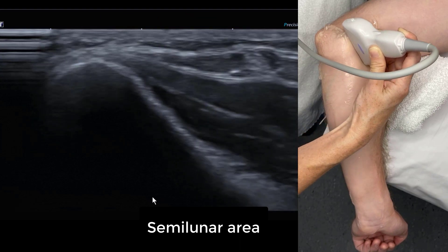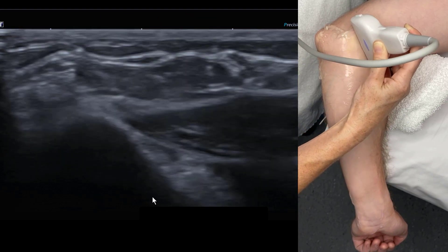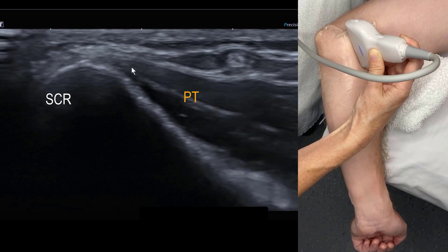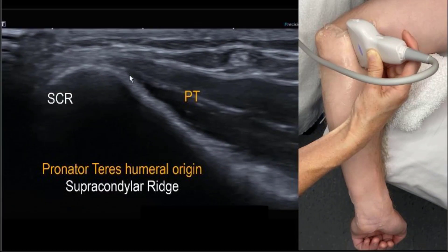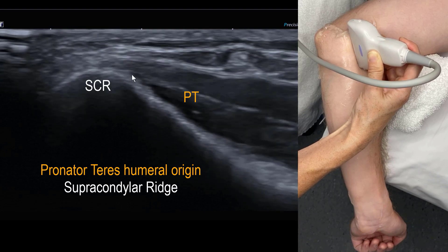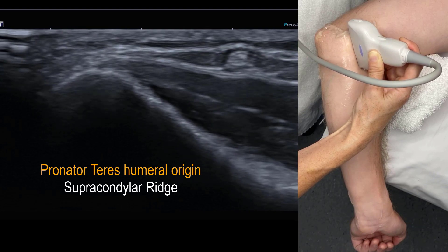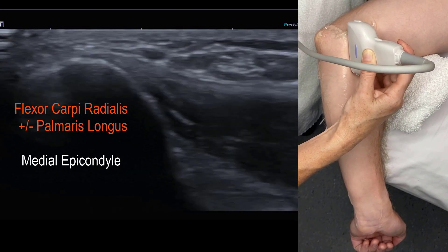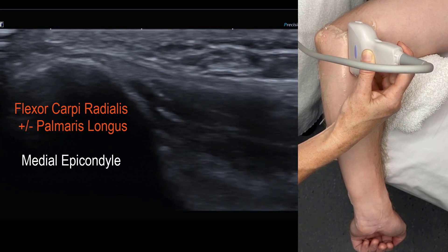As we move up towards the humerus, we lose that semilunar area and fall onto the muscular pronator teres. This is the humeral origin, so we also include this in any examination of medial epicondylar pain. We can use it as a landmark or stepping stone to the common flexor tendon examination.